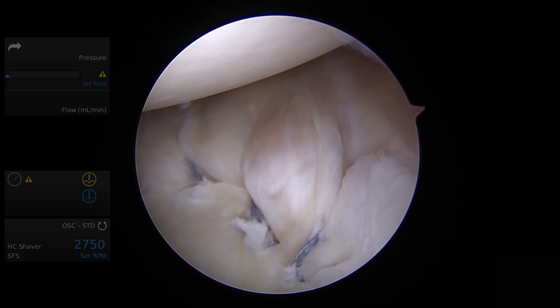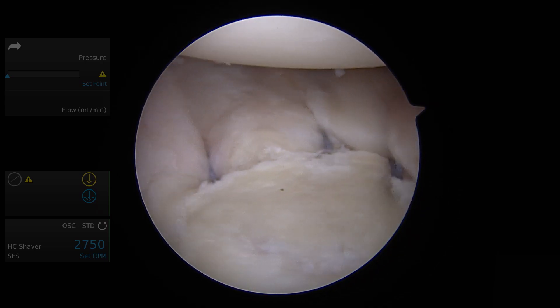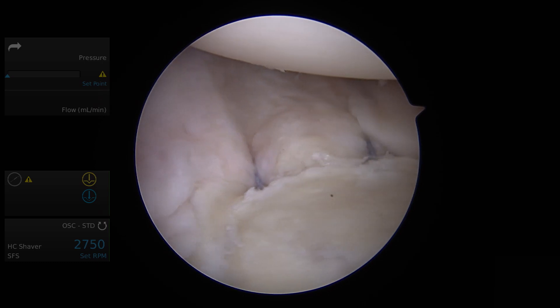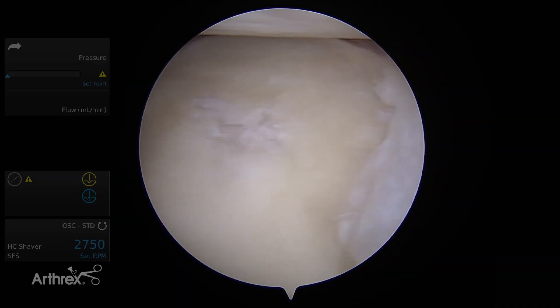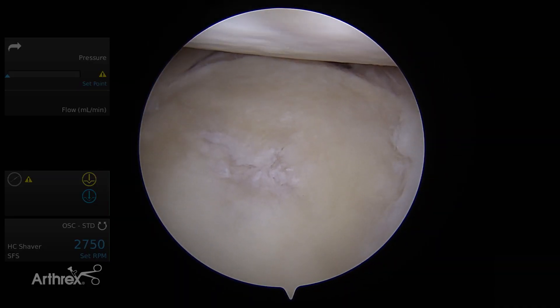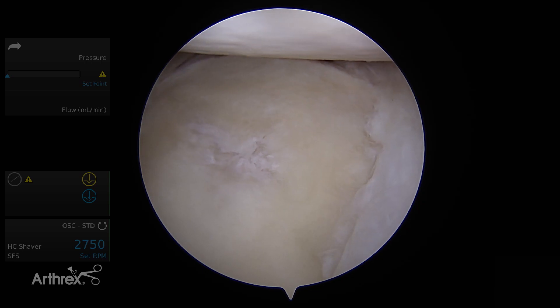I would like to share some of my favorite pearls for success using the Nautilus 1.8 FibreTac Anchor for shoulder instability. This is our typical setup: we'll be viewing from the anterior superior portal with Gemini cannulas in both the posterior and anterior inferior portals. This gives you excellent viewing and access to the anterior, posterior, and inferior aspects of the glenoid for repair.